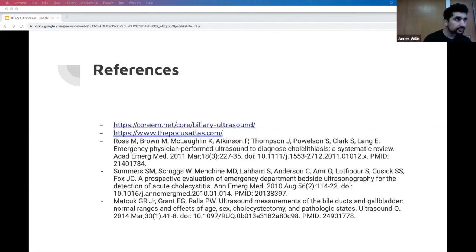Yeah. So Dr. Kilpatrick was saying that it's a very quick and easy procedure. You can incorporate it in your patients with GERD because it's a pretty missed diagnosis also. So when you're talking to the patient, you can do a quick bedside sono and incorporate that into your exam, and then you'll know if they have gallstones before they even tell you that they have abdominal pain.